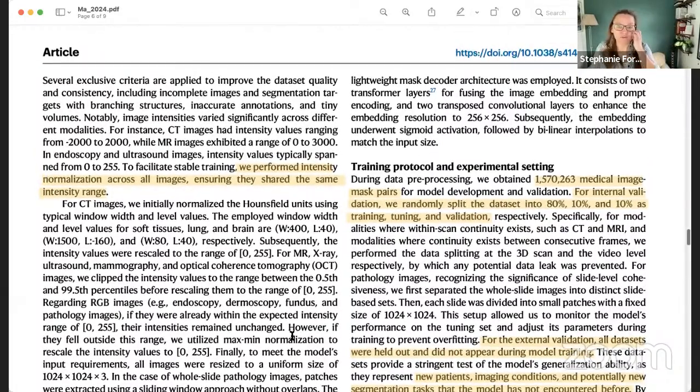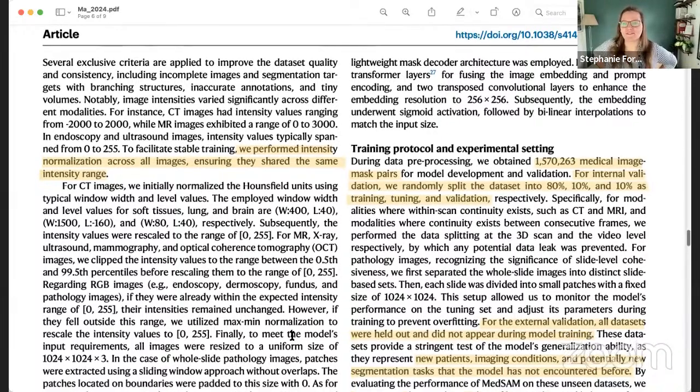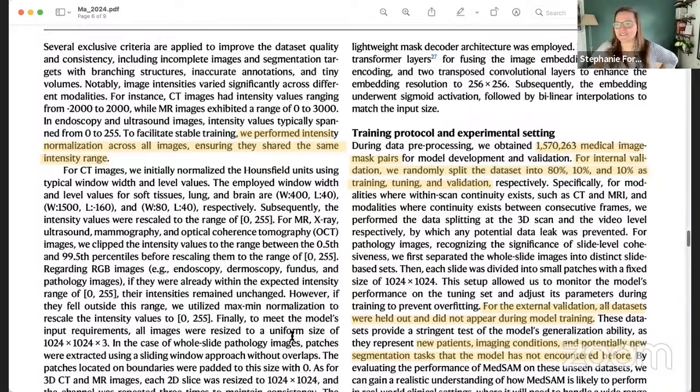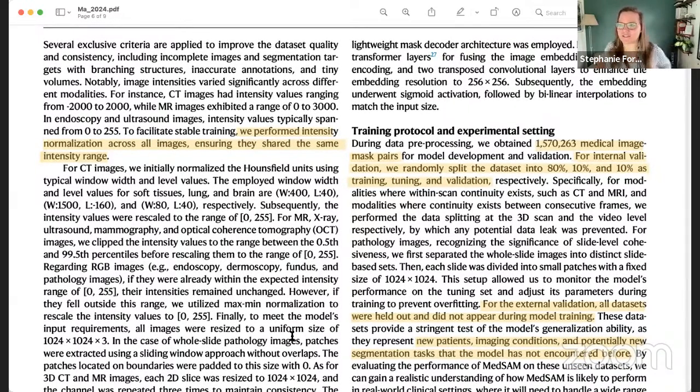Well, it depends on what the focus was in the end, but having segmented quite a few images, the sharper your image, the easier it is to segment. So then I guess we come down to how specialized the algorithm is to segment specific parts within an organ. Lilith has her hand up.